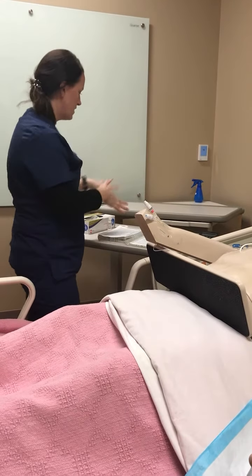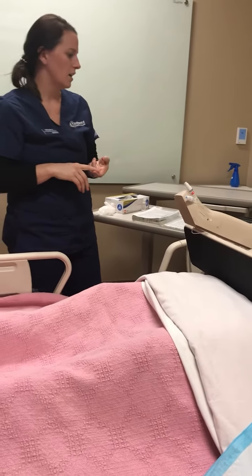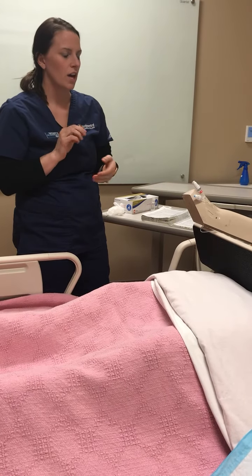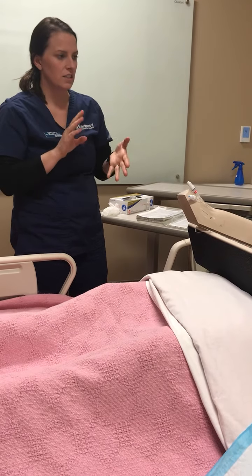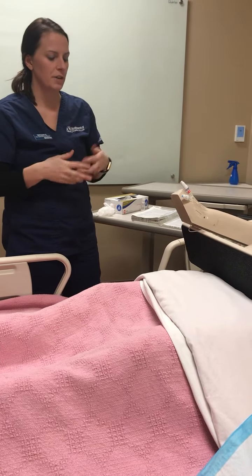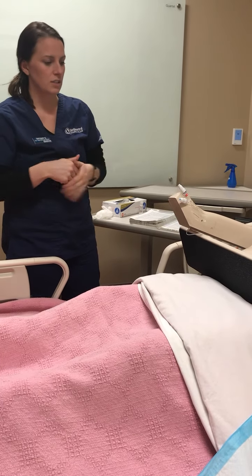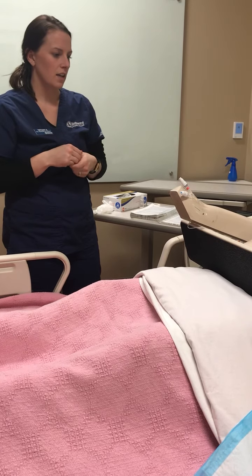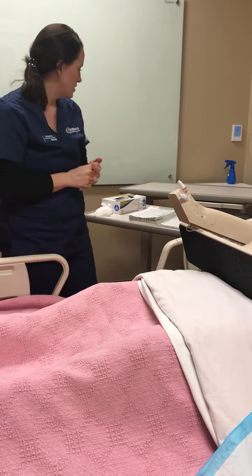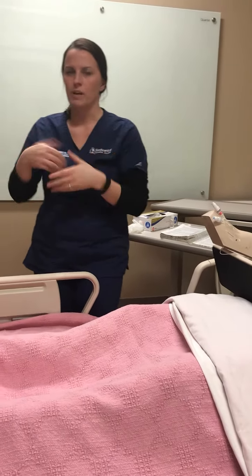And I cleanse my hands there, and then I'll go ahead and document. I want to document the medication, how much I gave, any reactions, and that no adverse reactions were present, so I want to document how the patient handled that, essentially documenting my 5 rights and the patient's response to that medication. And go ahead and wash my hands and exit the room.